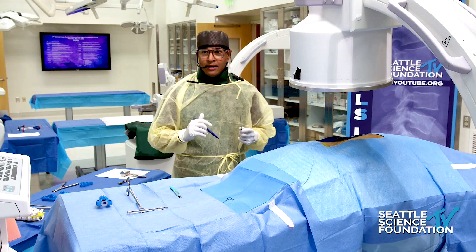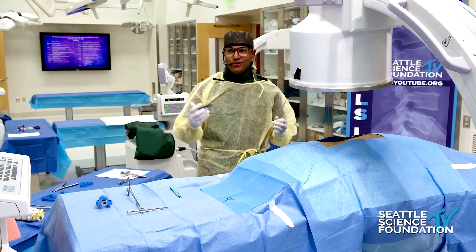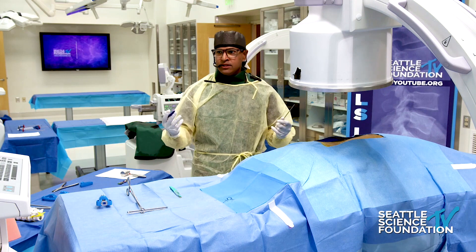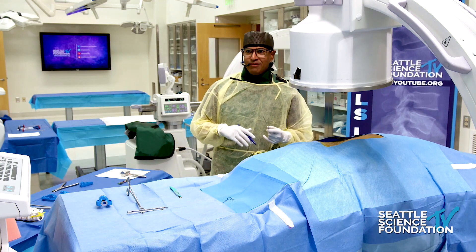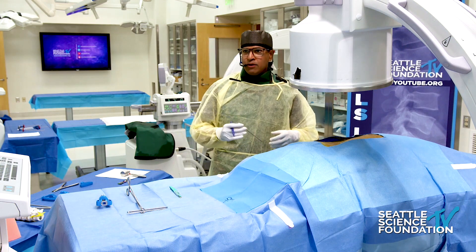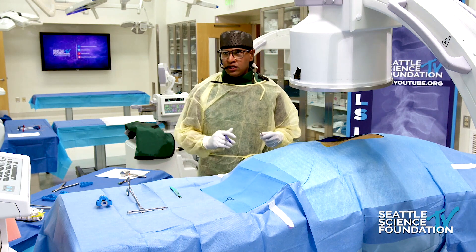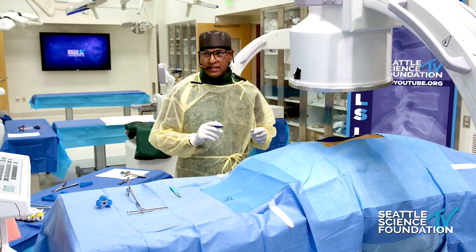I'm going to go through the procedure. If you've watched other SSF videos, you've probably seen me do this before, so I want to add some nuance and next-level additions. We have a beautiful cadaver based on the fluoroanatomy, and we're going to presume this patient has L3-4 stenosis. In other years I've done L4-5, so I thought I'd change it up.